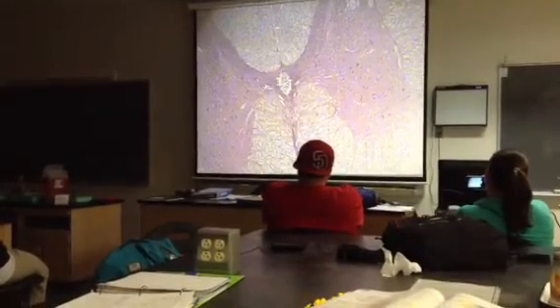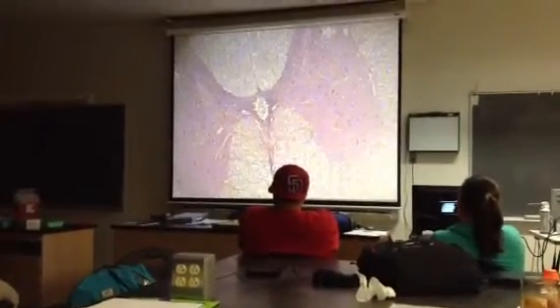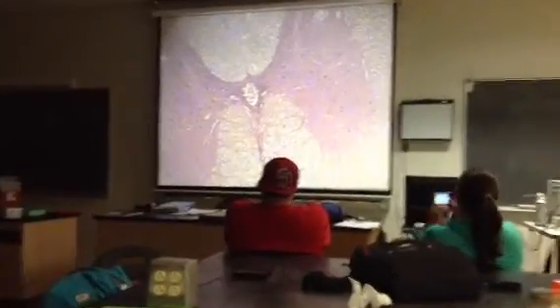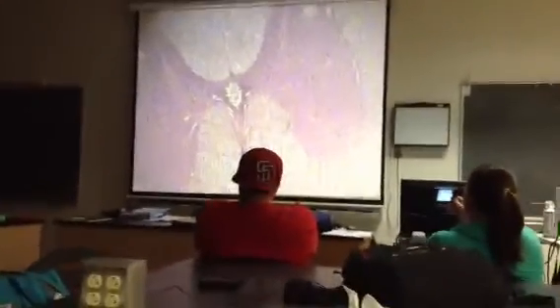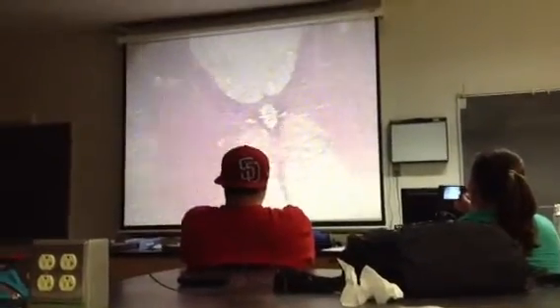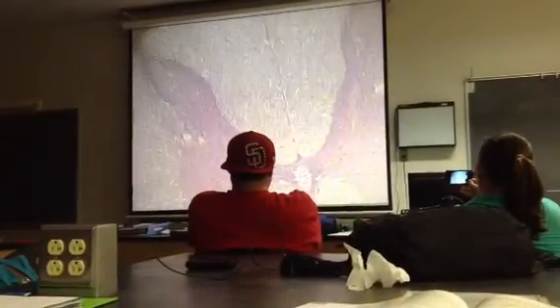Usually gray matter is the somas and the neuroglial cells, but sometimes there are some axons in there, though not so many. This is crossing over of axons to communicate with the other side of the spinal cord. But in general, you want to think of gray matter as somas and neuroglial cells, maybe some unmyelinated axons, but mostly somas and neuroglial cells. Okay, so there's your gray matter.